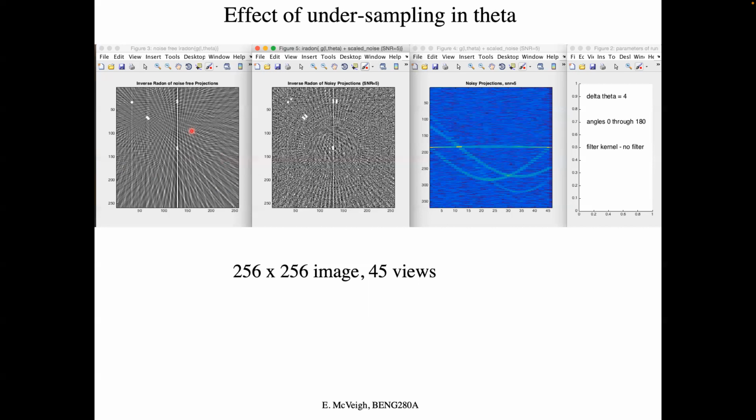If you take enough projections, they'll just cancel themselves right out. That's where you get to the analytical solution with that ramp function in Fourier space, or the convolution with the inverse Fourier transform of the ramp function, and do convolution back projection. You get back the original object.